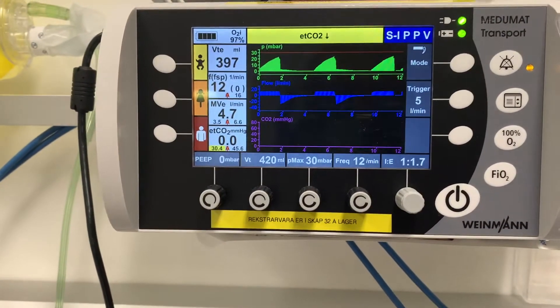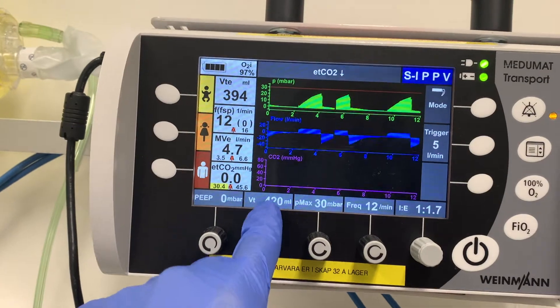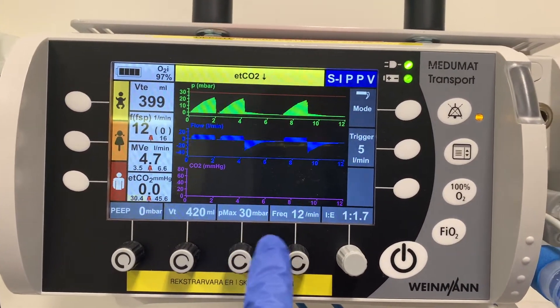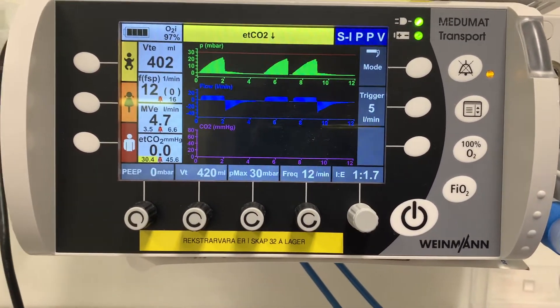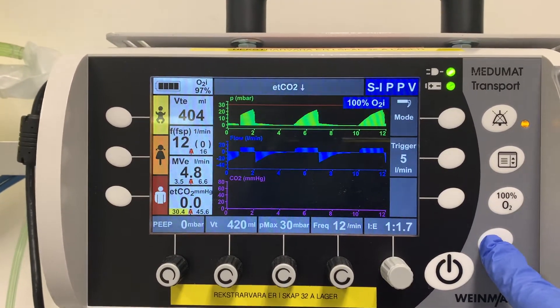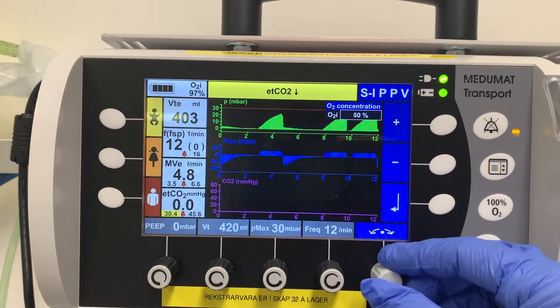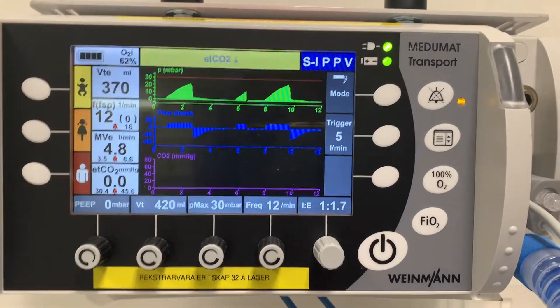There's no CO2 shown because it's not connected to a patient. In the settings, we have PEEP set to zero, the tidal volume calculated from the patient's ideal body weight, and Pmax — the pressure max, which is not the plateau pressure — along with frequency and the inspiratory-to-expiratory ratio. For a shortcut to 100% FiO2 it's right here, or you can press FiO2 and titrate the oxygen concentration manually.